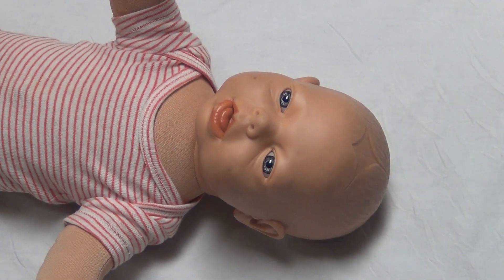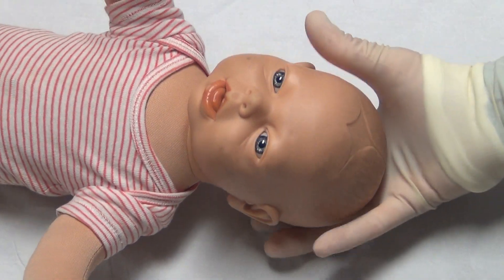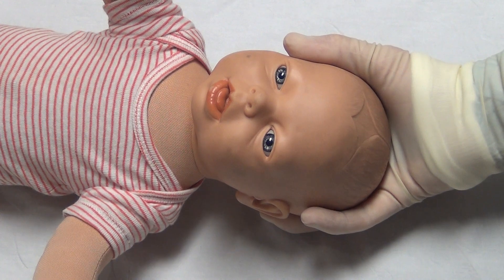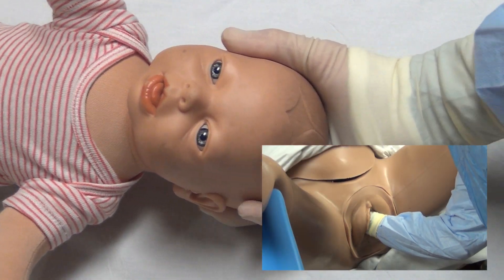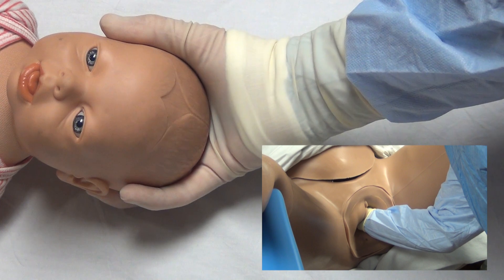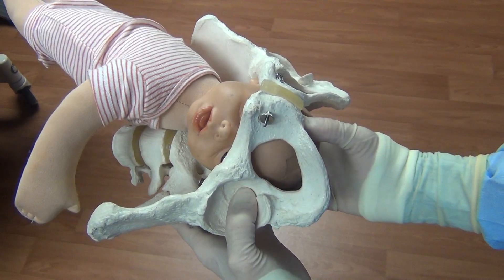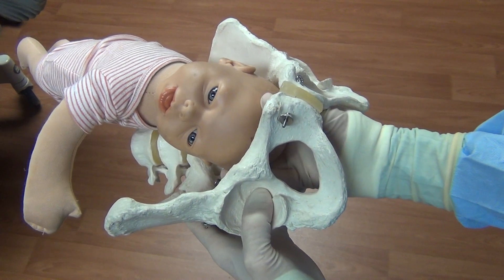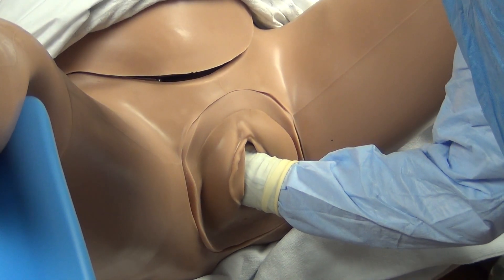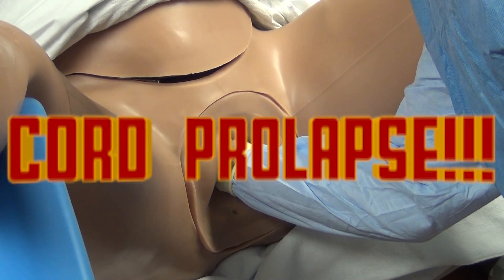Once the rotating hand's fingers are placed evenly across the occiput of the fetal head with the thumb alongside the right parietal bone, the fetal head station is first gently reduced by pushing in a superior direction. This allows the rotation to occur in the mid-pelvis to pelvic inlet, where there is more space for the rotation. Care should be taken not to reduce the station too far, as this can precipitate a cord prolapse.